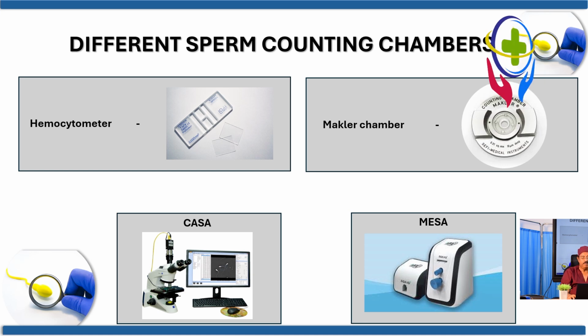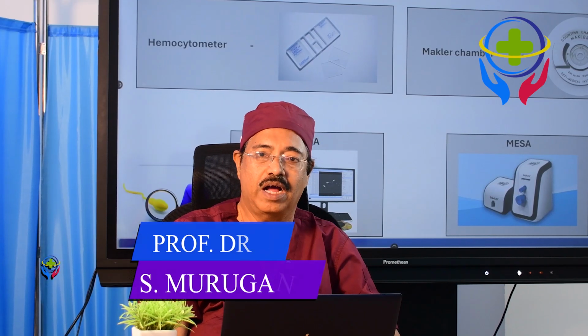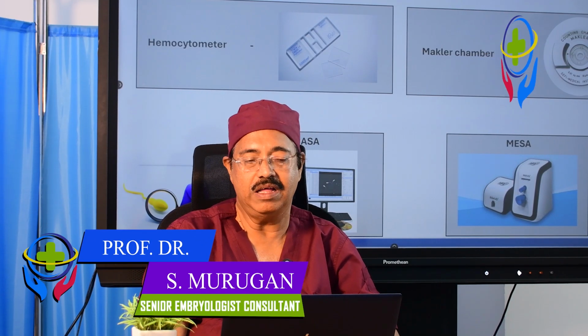In modern times, we are using computer-assisted sperm analyzers, and after that there are so many sperm counting chambers available in the market at a lower price and more precise in giving the report.